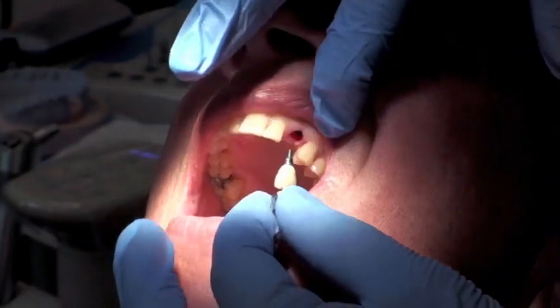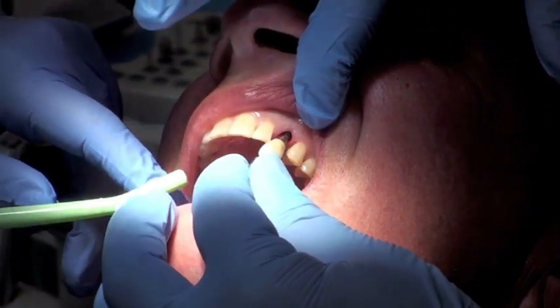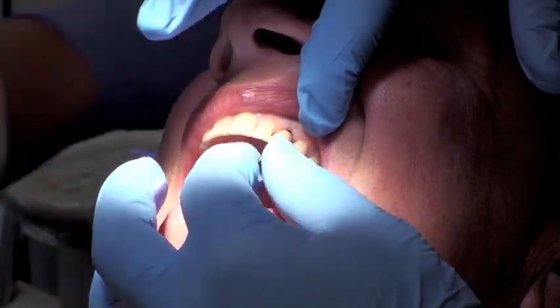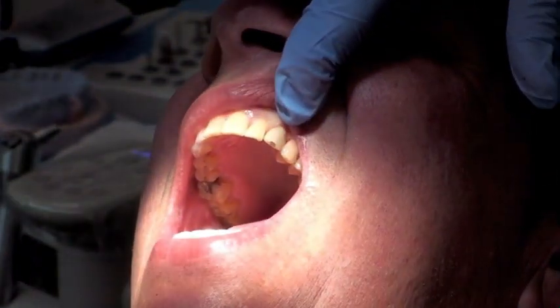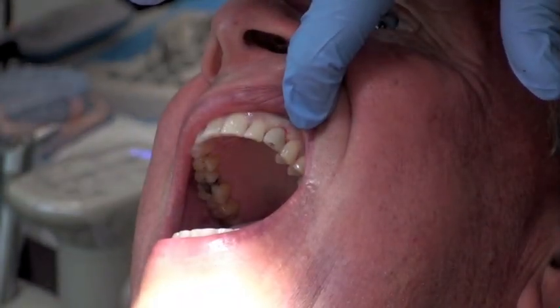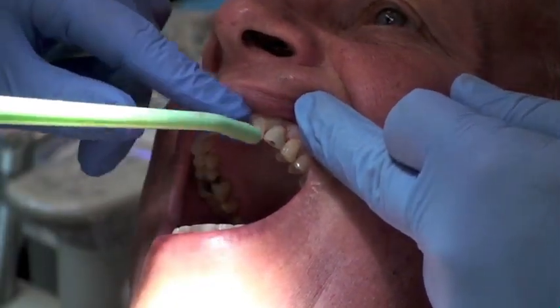So what you see here is a screw retained provisional that I fabricated prior to the surgery. Everything that you see here was done before the patient was ever treated clinically. What we're doing here is just screwing on the prosthesis, checking the fit and the accuracy. We'll adjust the occlusion to make sure that this tooth is completely out of occlusion so that true osseointegration does occur.